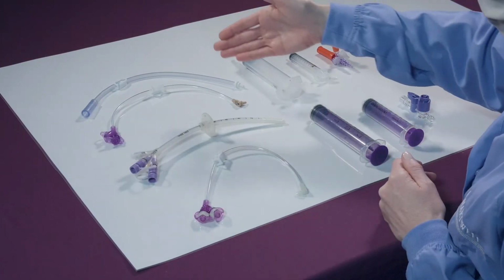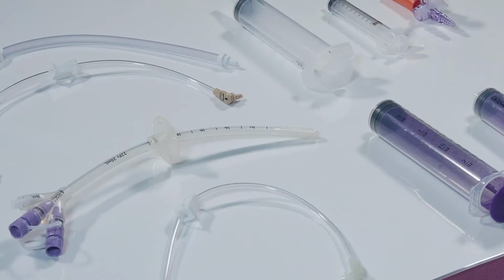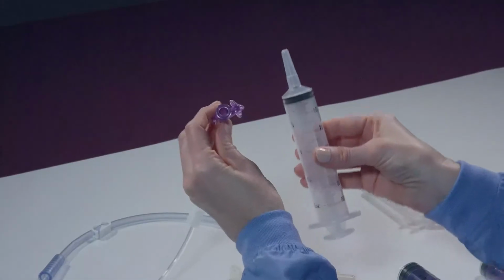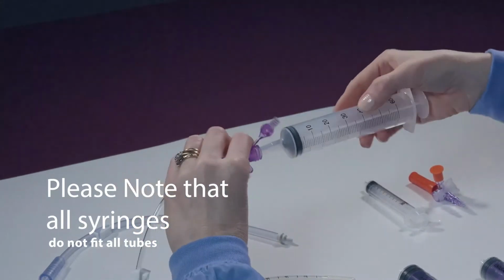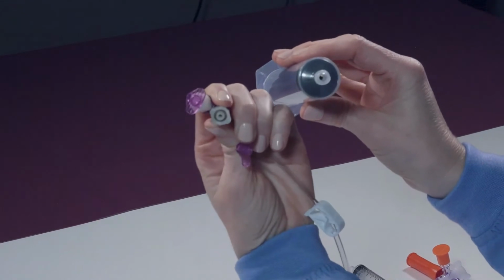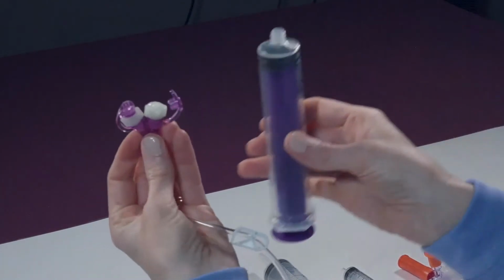Feeding tubes vary and require different supplies. Some feeding tubes will have clamps and some will not. Traditional feeding tubes can be used with a slip tip or cone-shaped syringe, while ENFit feeding tubes require supplies with special ENFit connections. Your nurse or dietitian may recommend using a valve attachment device at the end of your tube to open and close it. These too have traditional and ENFit options.